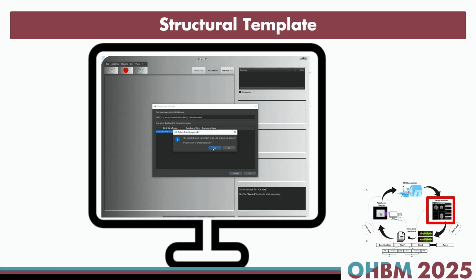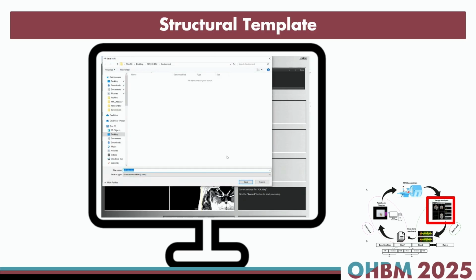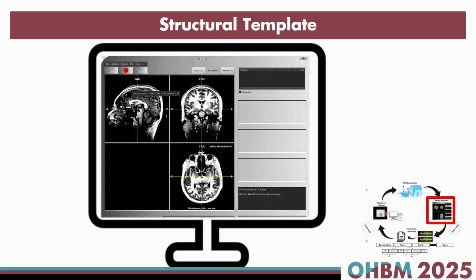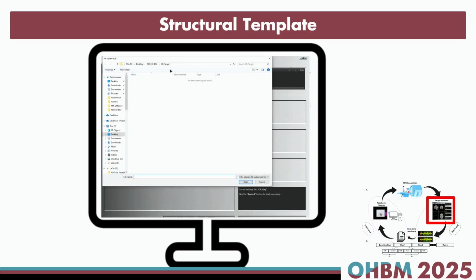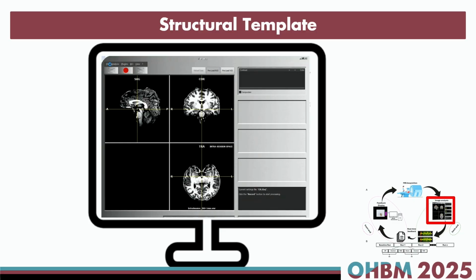After that, extract the brain itself and correct any inhomogeneity in the brain. And also make it a MNI standard template. Because it's important: you want to receive activation in real time, and you want to put that ROI mask on the brain. You've already defined your ROI mask based on the MNI template. So it's important to have the structural data of every participant based on an MNI template.